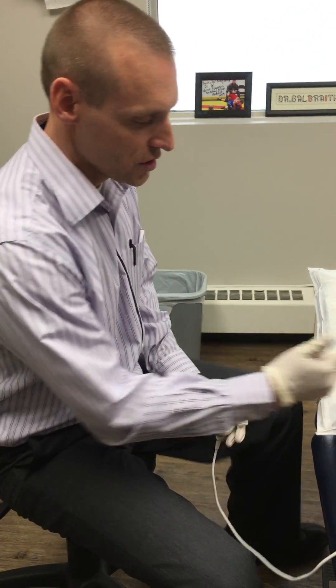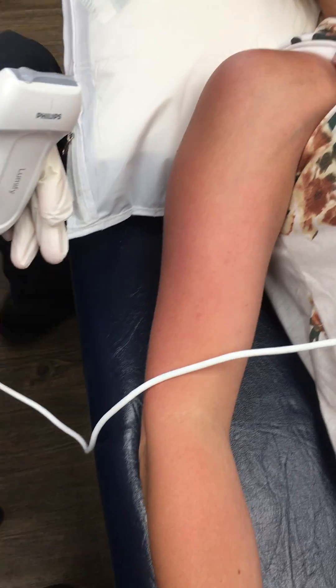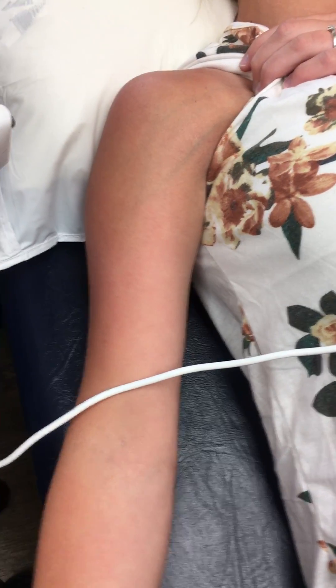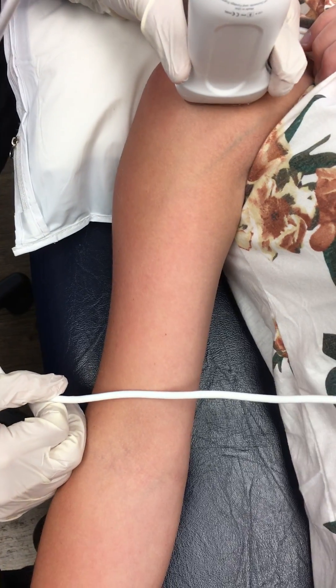We're gonna do a bicep tendon injection just around the sheath. I've just prepped the area right now so I'm not gonna touch it. Under ultrasound, I'm just gonna turn palm up — usually the bicep tendon should run roughly anterior. I'm gonna look under ultrasound now to identify my landmarks.